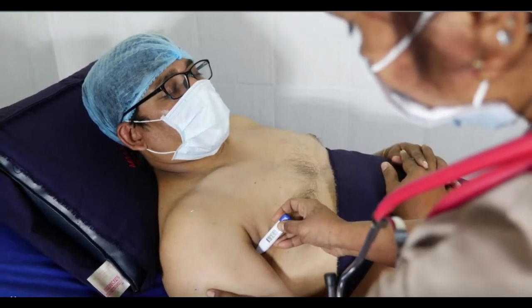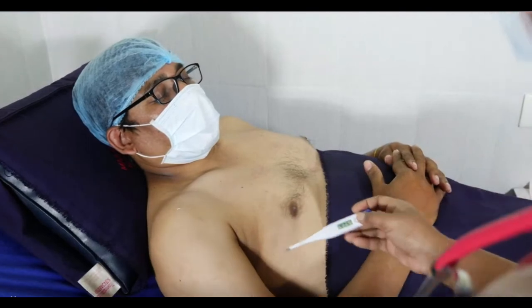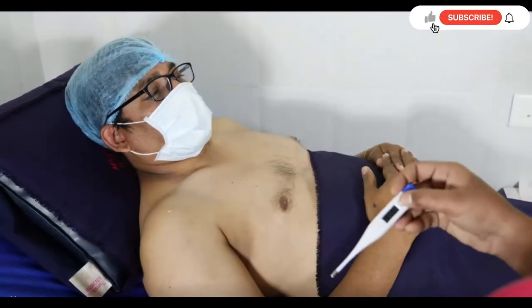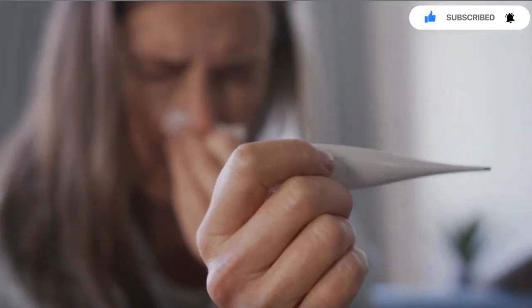The thermistor is a ceramic semiconductor which is bonded in the tip with temperature-sensitive epoxy. It is covered with a cap to protect it from the outer world. The cap may be made up of metal or stainless steel.